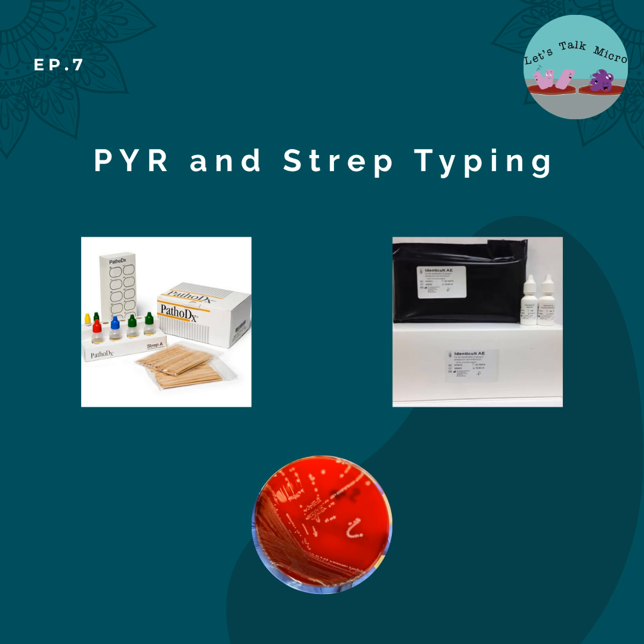There are two species that are positive as far as gram-positive cocci in chains. Now, do you remember which ones are those? Enterococcus and Streptococcus pyogenes. They're both positive. And then the other streps like Strep viridans, Strep agalactiae, all the other streps, they're negative. So keep that in mind. So that differentiates Enterococcus and Streptococcus pyogenes from other strep.